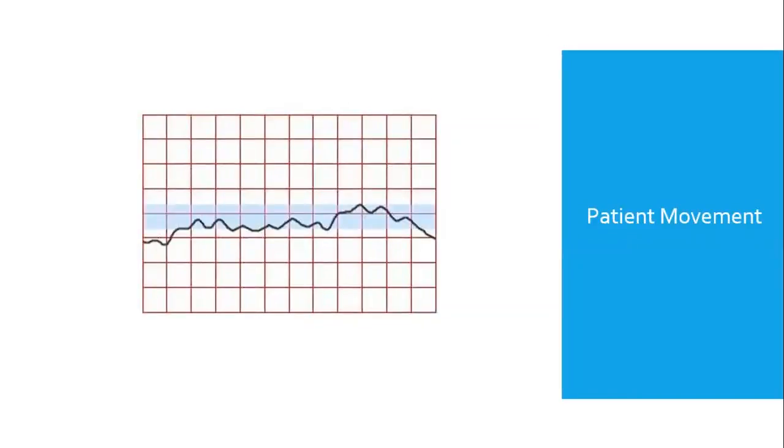Slight movement, including talking, can also affect the PADnet test. On this slide is an example of how movement appears in the PVR waveform and also requires a retest of the segment.